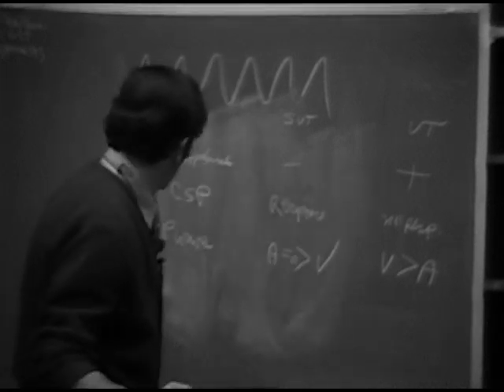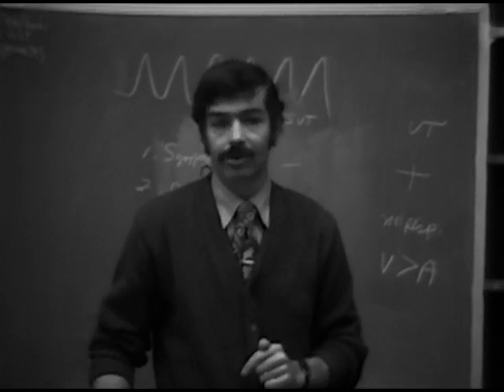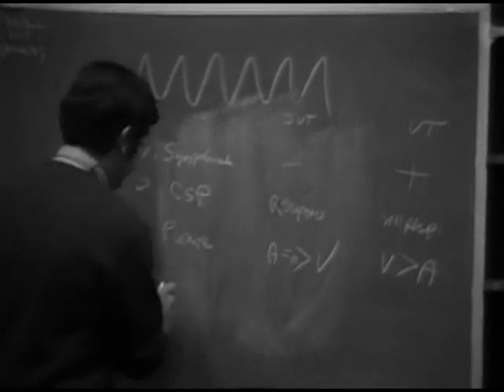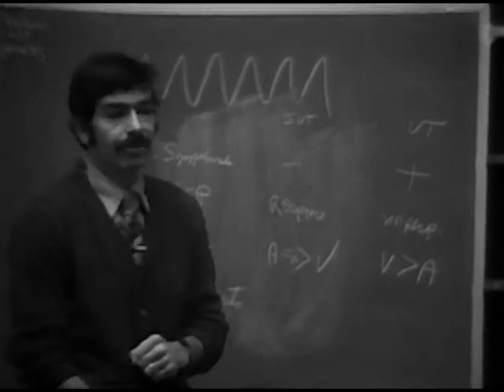Do you have to see a capture beat? That's the fourth thing that you can look for in the electrocardiogram, the presence of capture beats. Capture beats can also be helpful. And when you see a capture beat, what does that mean that you have?